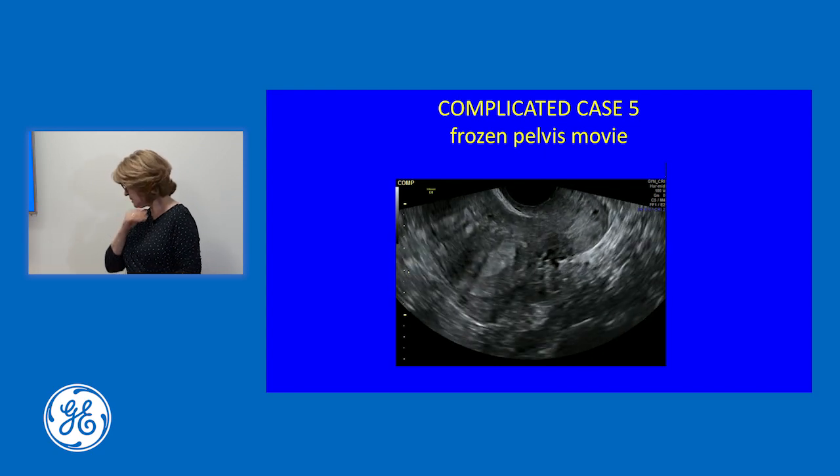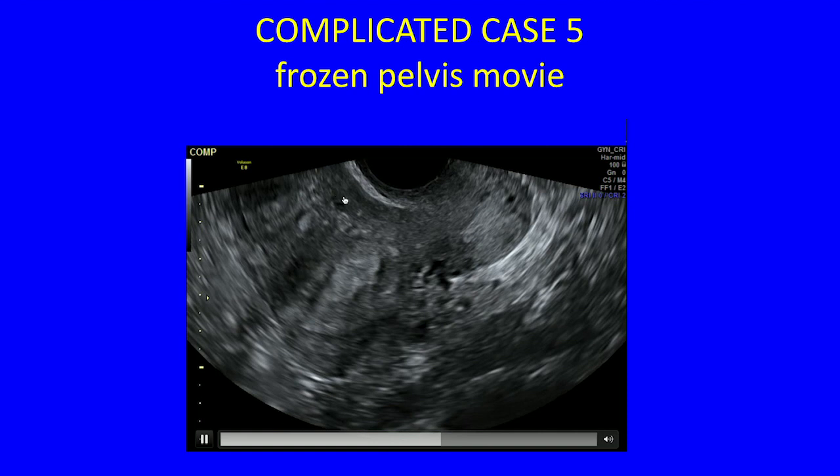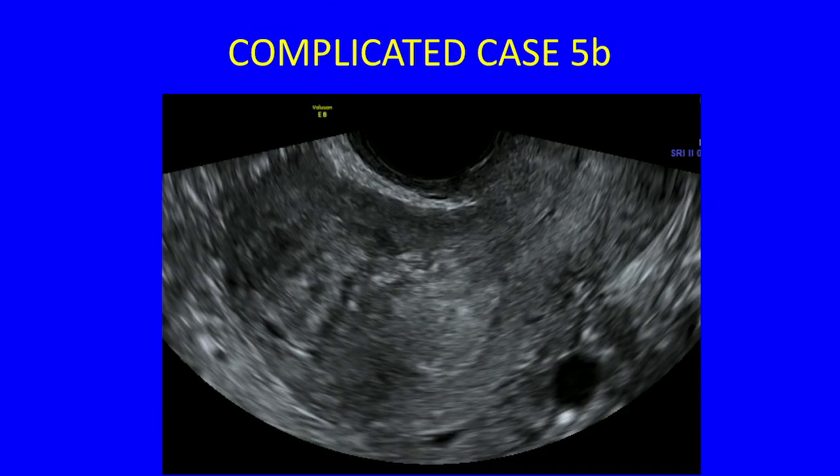If we look a little bit more in detail, you can see there's all sorts of heterogeneity going on here. Looking at her in 2D, you can see the endometrial cavity. Well, exactly where is it? The endomyometrial junction is quite blurred. There are islands of endometrial tissue, white. There are little hemorrhagic islands. This is the torus. So I said this is the bladder, this is the internal os, and at the back this is the torus, and that's always the center of endometriosis.